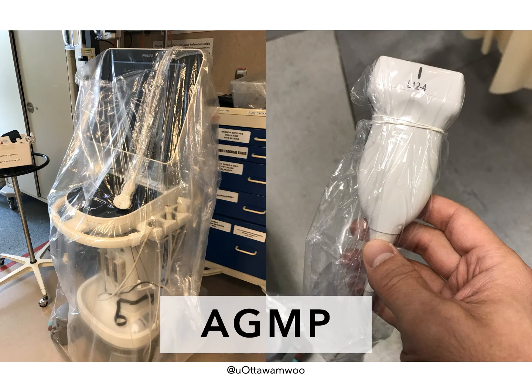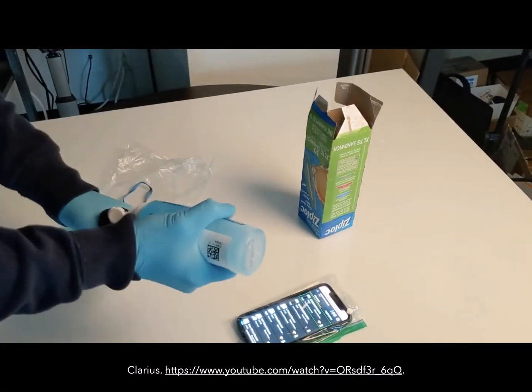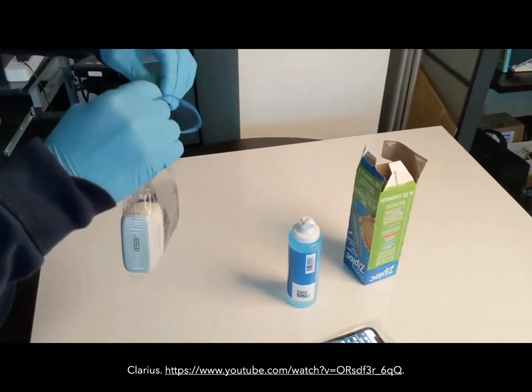If you're planning on scanning in a patient room where aerosol-generating medical procedures are taking place, consider covering your machine and your probes and cords in plastic. It's challenging with cart-based machines, so this speaks to how much easier handheld devices are to manage. A handheld can easily be placed in a plastic sandwich bag, as can your smartphone.